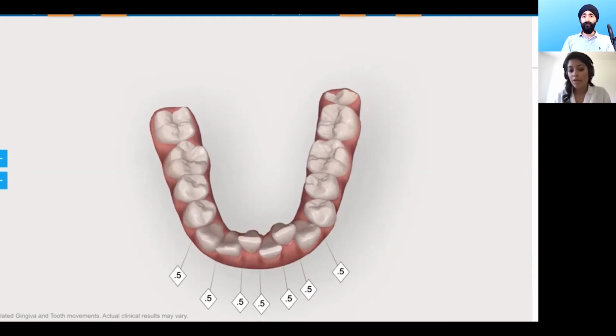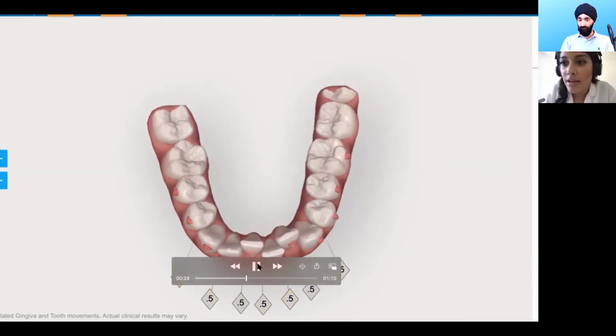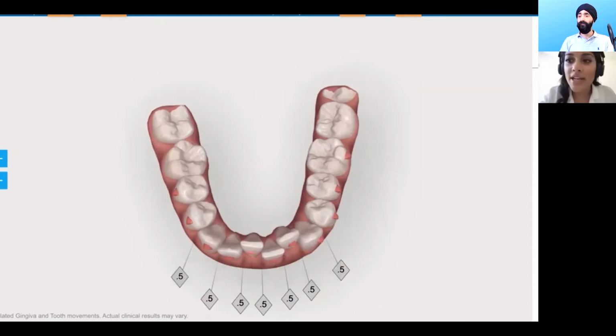So if we look at these, I'll always start by getting the 0.1 in. And once I know I've got my 0.1 in, and the 0.1 is so thin, some people have this space between their teeth already. And then after that, I'll go 0.2. You can even get other ones where they have 0.15, 0.2, 0.25.